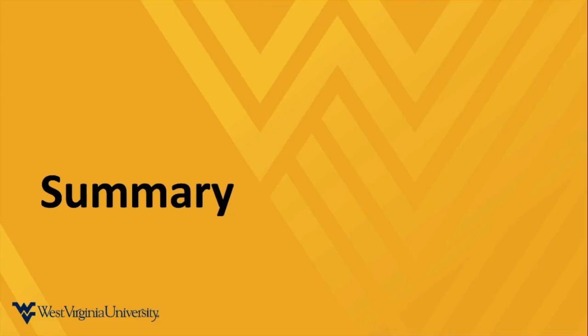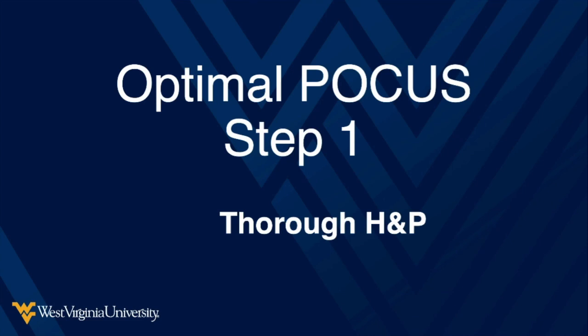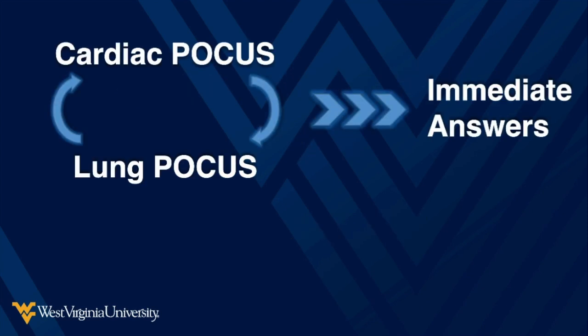All right, so we talked about a lot there. We talked about how when a patient's short of breath, you can look at their heart, look at their lungs, make some immediate decisions, shorten your differential, make some important diagnoses right away, quicker than any other tests are going to come back. The first thing to remember is that your most important first step is a thorough history and physical, because that's going to give you context, it's going to focus your ultrasound efforts, and then help you integrate the findings into the whole clinical picture. Do your heart and lung ultrasound, get yourself some immediate answers, actionable information.